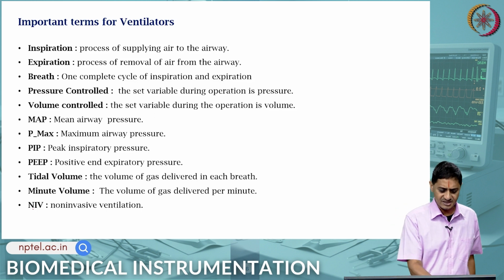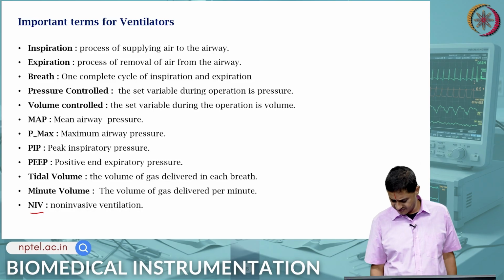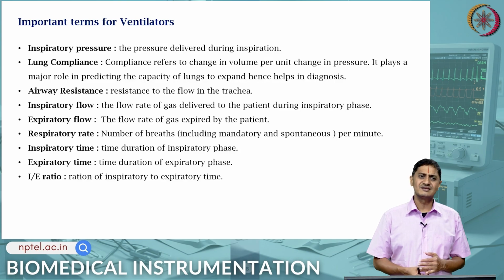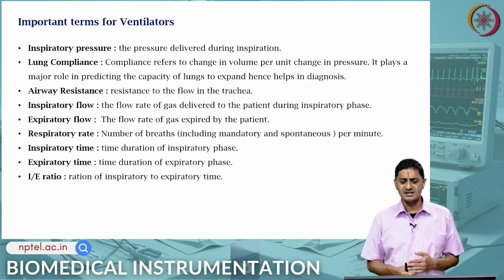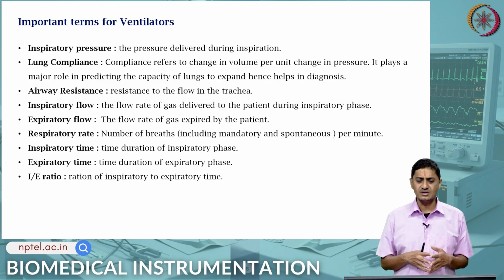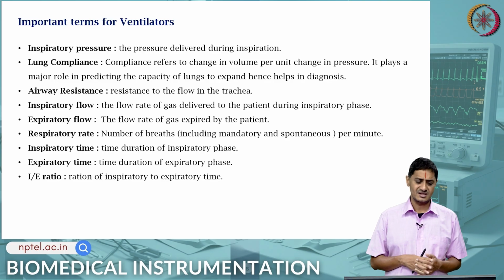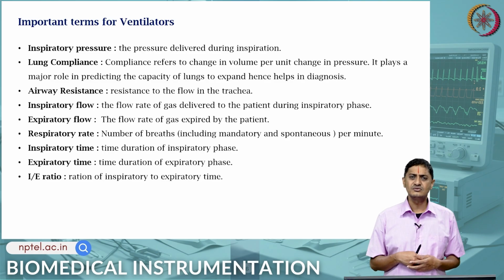NIV means what? NIV means non-invasive ventilation. NI means non-invasive, V means ventilation, non-invasive ventilation. The pressure that is delivered during inspiration is called inspiratory pressure. Compliance, I already discussed what this is. This is the change in volume per unit change in pressure. This is a fundamental measure. It plays a critical role in predicting the capacity of lungs to expand and essentially is a critical measure of lung health. Airway resistance is essentially the resistance to flow of air in the trachea.